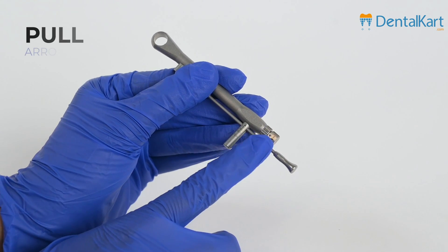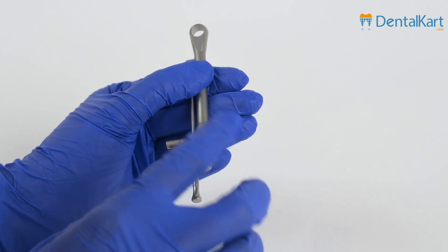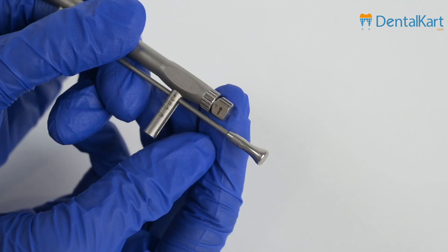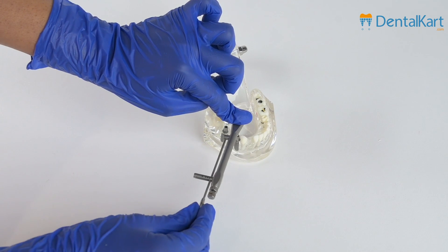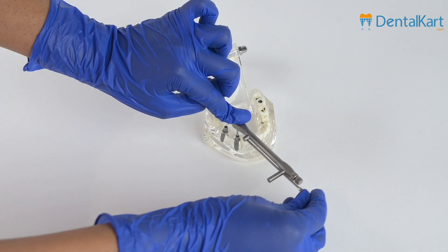Let's see the function of this arrow lock. The direction of the arrow indicates which movement you are performing — whether you are tightening the screw or loosening it. It holds the drivers in place: anti-clockwise is loosening and clockwise is tightening. Make the arrow point accordingly.